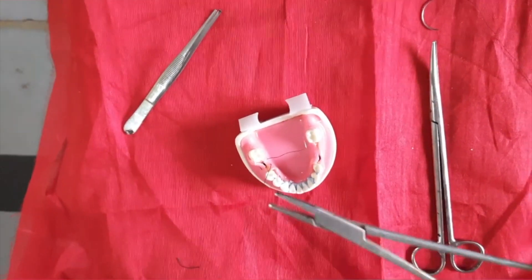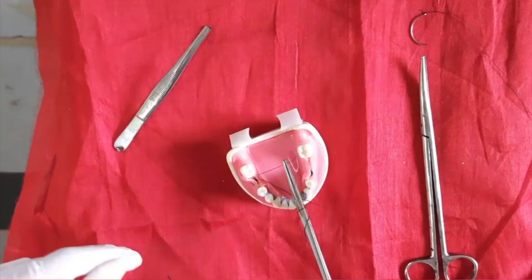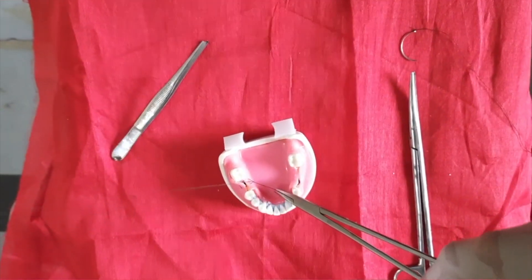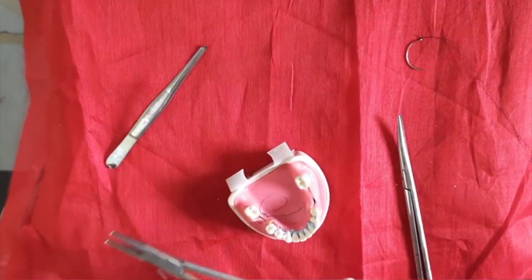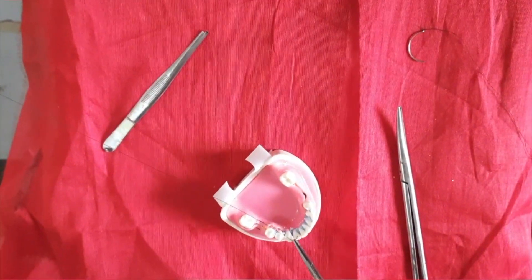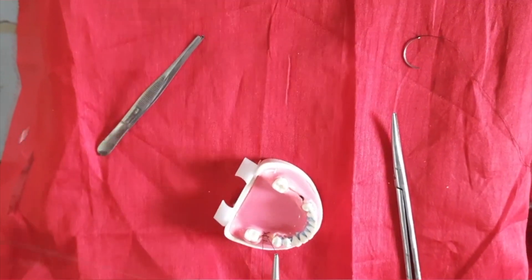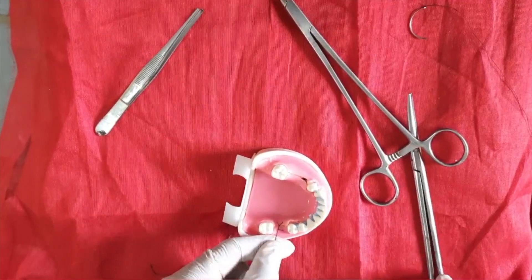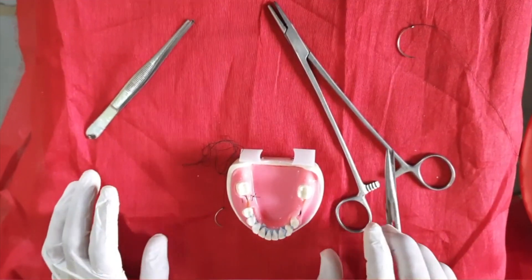For the first knot, hold it and round it two times. Hold the other end properly and make the knot. Then cut the extra end. So this is the horizontal mattress suture, completed.